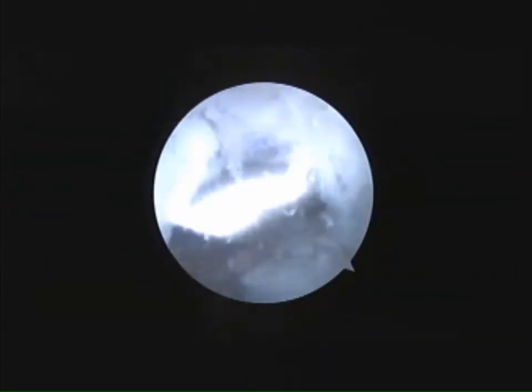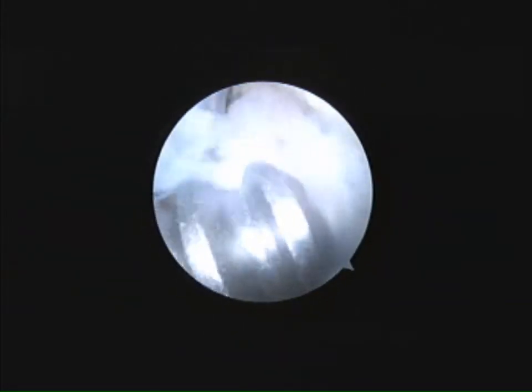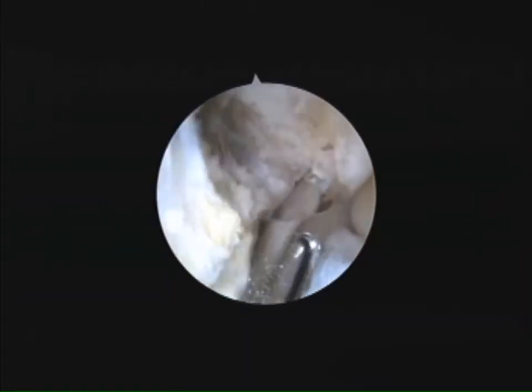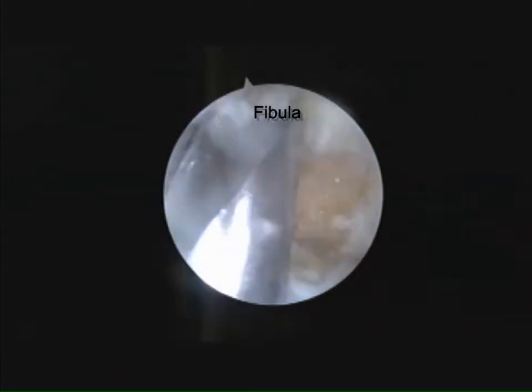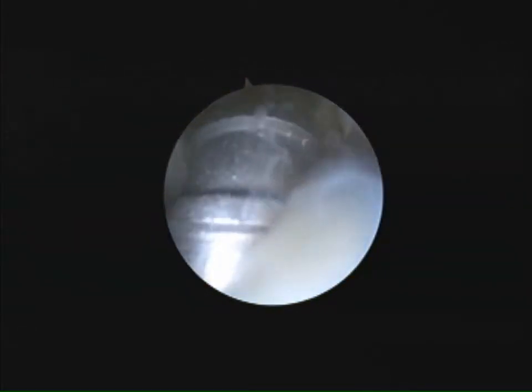First, a fibular anchor hole is created medial to the fibular footpoint of the ATFL. The fibular footpoint is refreshed using an arthroscopic burr, and a fibular anchor hole is created.